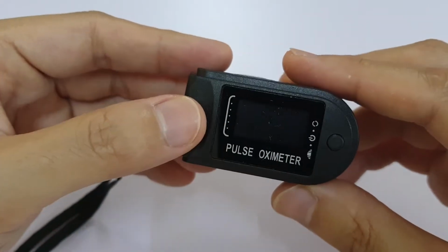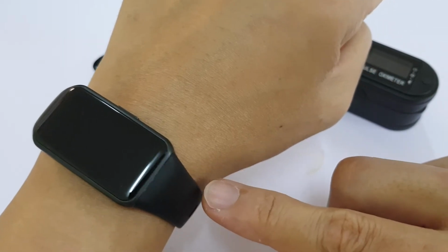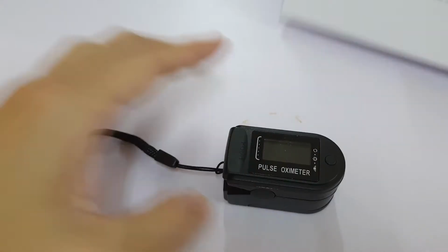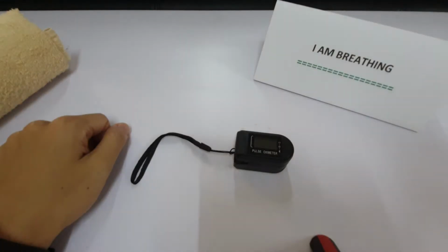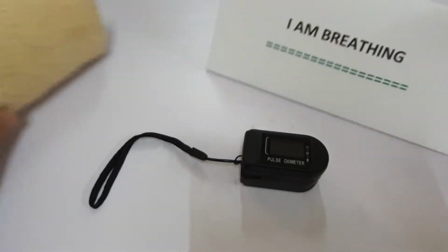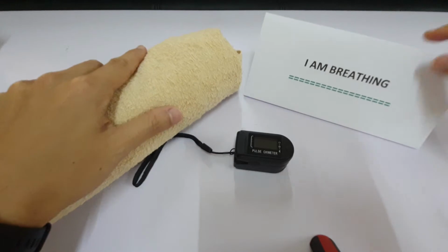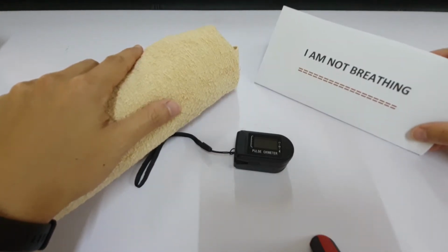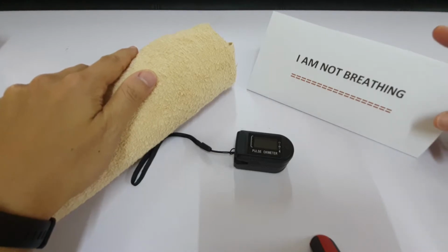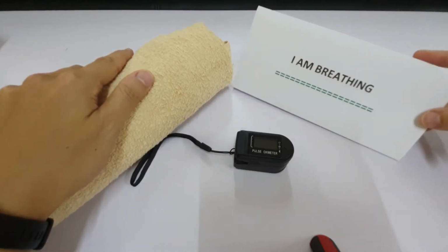So we're going to compare this against a fitness band with a SpO2 measurement. Let me just switch a bit over to wide angle. Just zoom this in. I have a sign that says I'm breathing or I'm not breathing. I want to stop breathing and see how my oxygen levels react to what I'm doing. Right now I'm breathing.